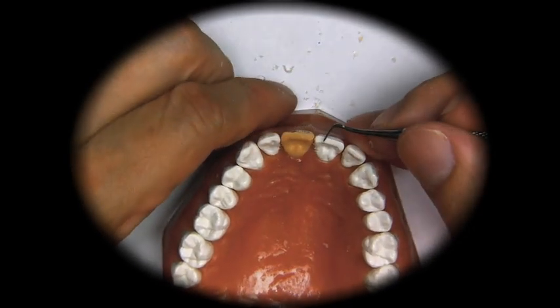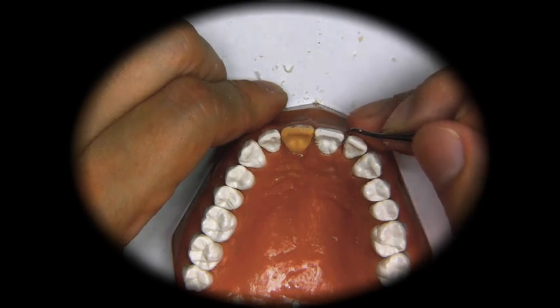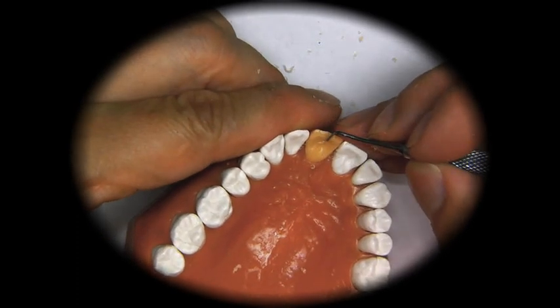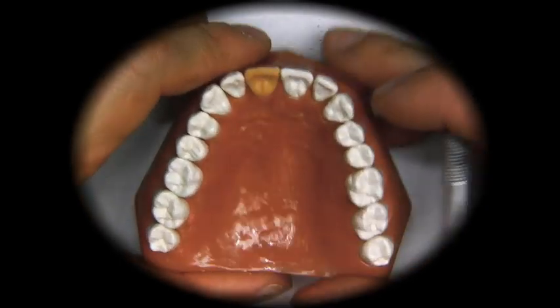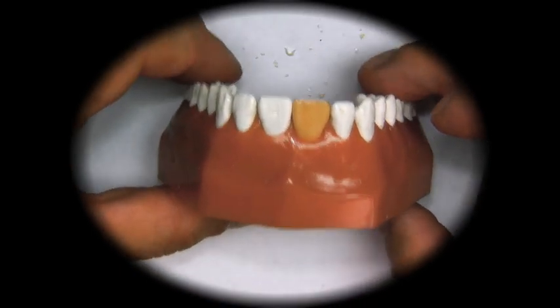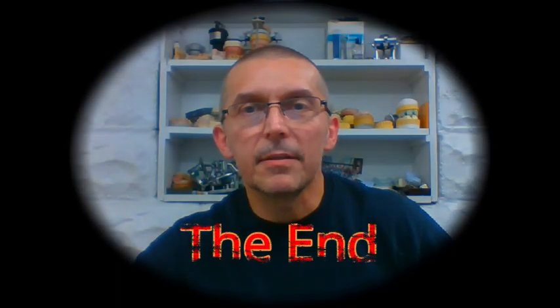When you see these incisal edges which seem to be worn, generally you will want to mimic that on the adjacent teeth so that we can make it look the same. So this is our central incisor. Happy waxing, everyone.